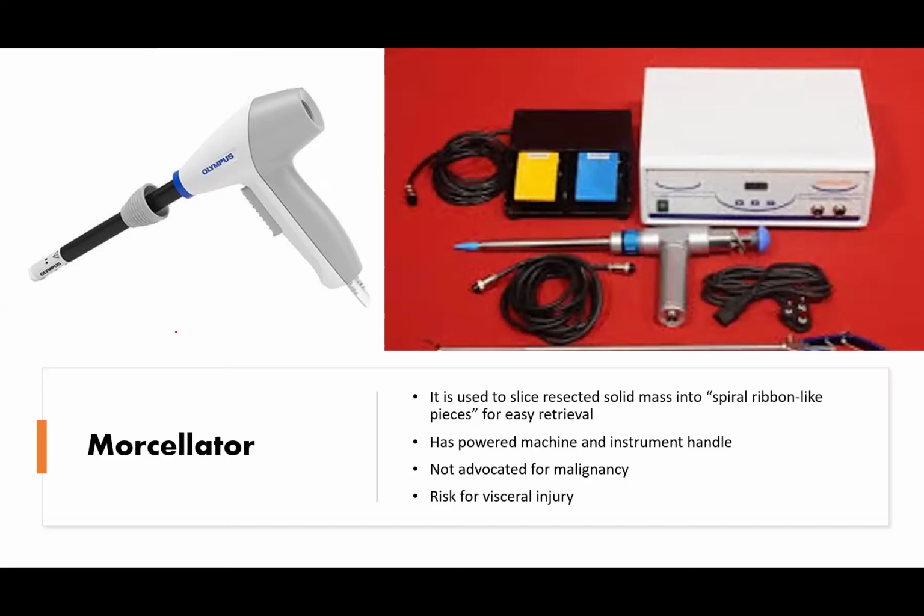Now, it has a powered machine and instrument handle, as you can see. It is not advocated for malignancy because if you morcellate a malignant specimen, you are going to disseminate that malignancy. It has risk for visceral injury.